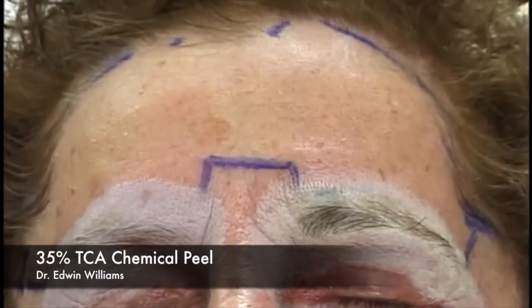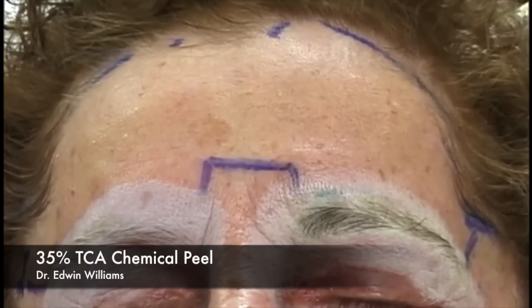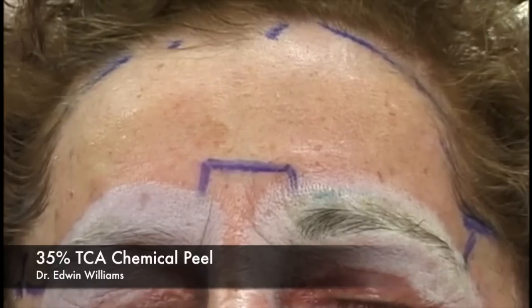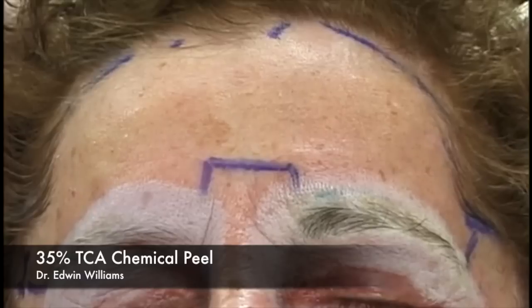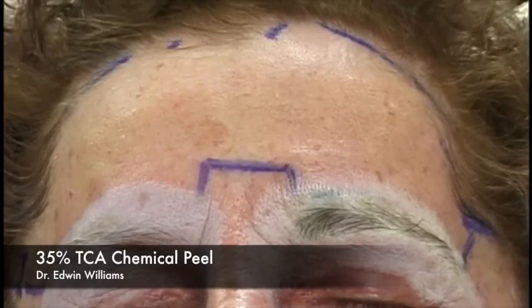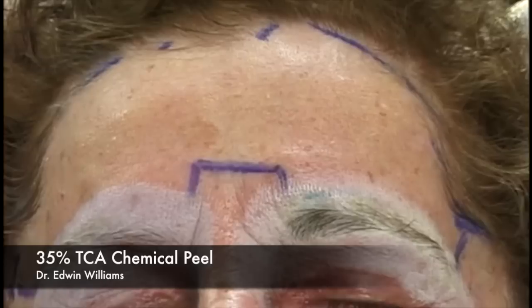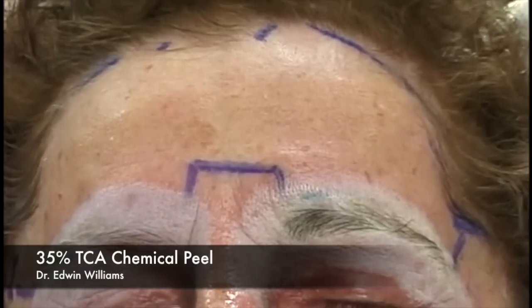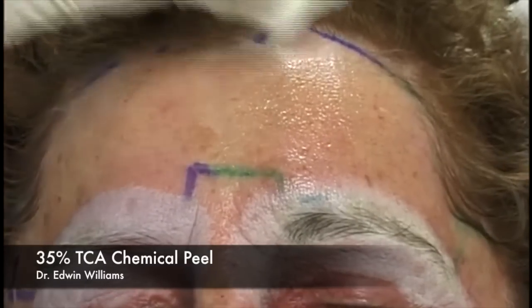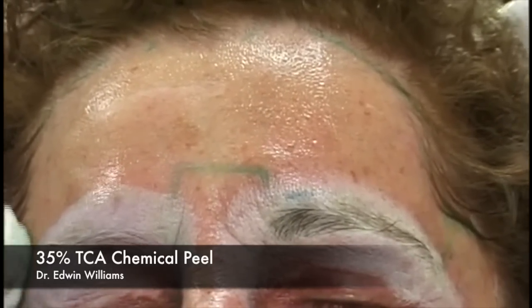Now that we've given the Demerol and completed the periorbital area, we extend up onto the forehead. We prefer to peel superiorly and move inferiorly so a drip of peel solution won't inadvertently run across already-treated areas unnoticed. We may also give a little more Versed. We do the nasal skin first, then the entire forehead and temporal unit, taking the peel into the hairline and being careful not to go beyond the marked temporal unit.